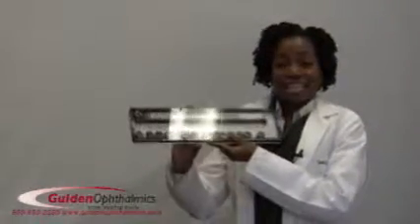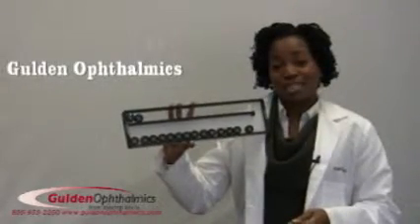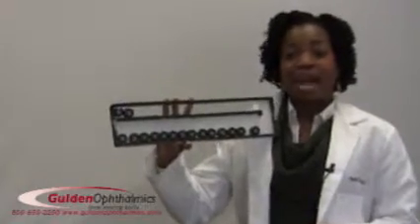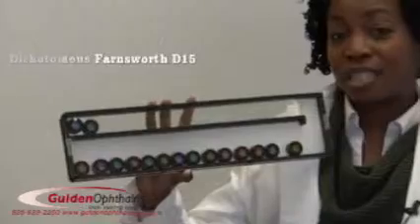Hello, I'm Dr. Ruth Shogay, and I'd like to introduce you to another excellent product, the Distinctive Compact Magnetic D15 by Gulden Ophthalmics. The Compact Magnetic D15 kit is a compact version of the popular Magnetic Farnsworth Dichotomous D15.